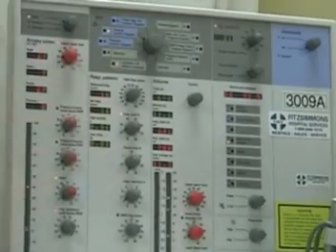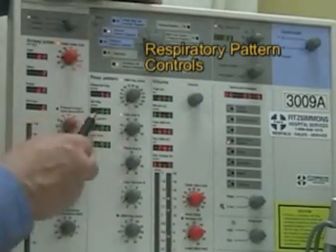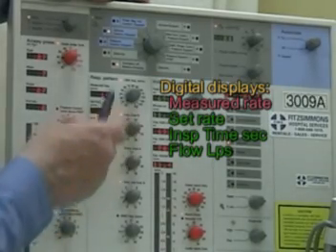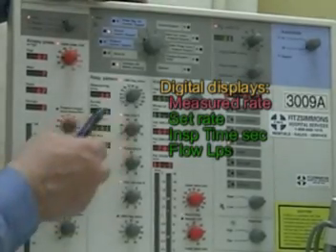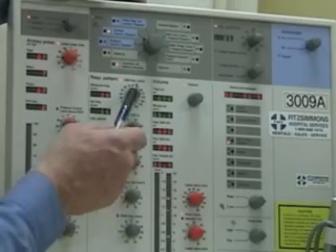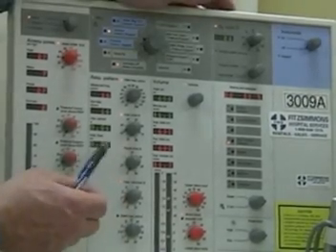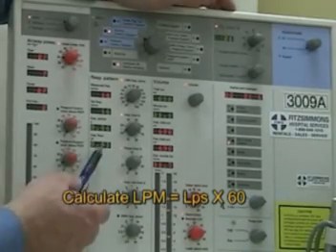Here is the mode selector. Below it is the respiratory pattern section. We have four digital displays: the measured frequency showing what the patient is actually breathing (red), the CMV rate knob setting, inspiratory time in seconds, and flow in liters per second. At a rate where 25% of the total time is inspiratory, we get an I-time of 0.86 seconds. To get liters per minute, multiply liters per second by 60.